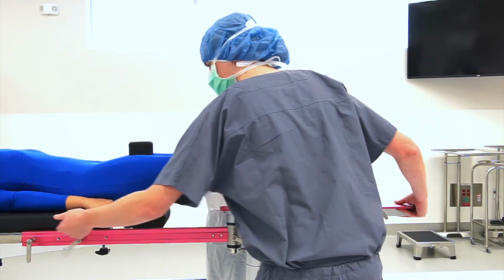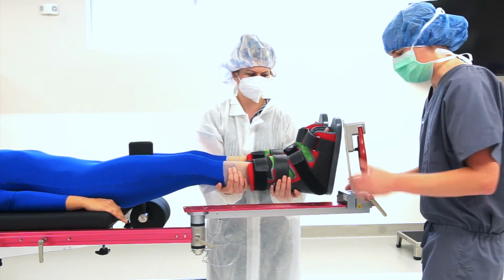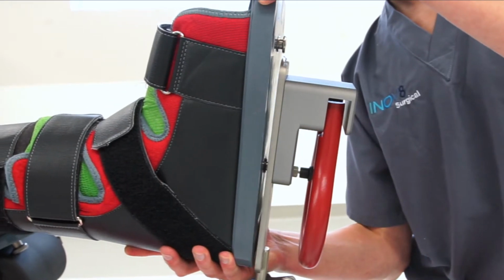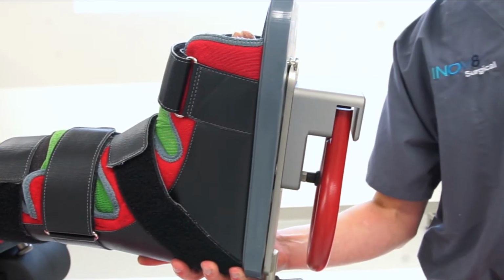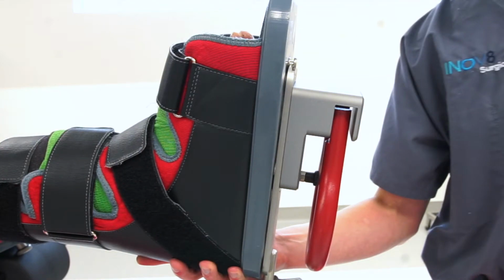Adjust the OLH for proper leg length by sliding it along the OR table side rail. You can also use the slide lever on the ball heel slider to adjust for leg length. Attach the traction boot to the boot holder. This is done by guiding the lower fixing knob into the lower recess, then guiding the upper fixing knob into the upper recess. You will hear it click into place. To remove the boot from the OLH, pull the black pin and pull up on the traction boot.